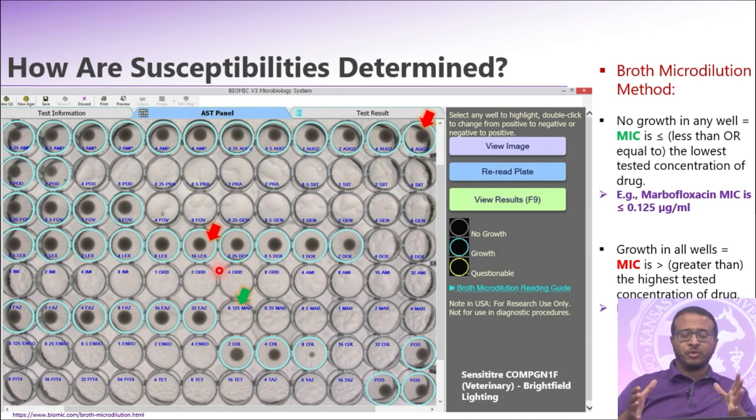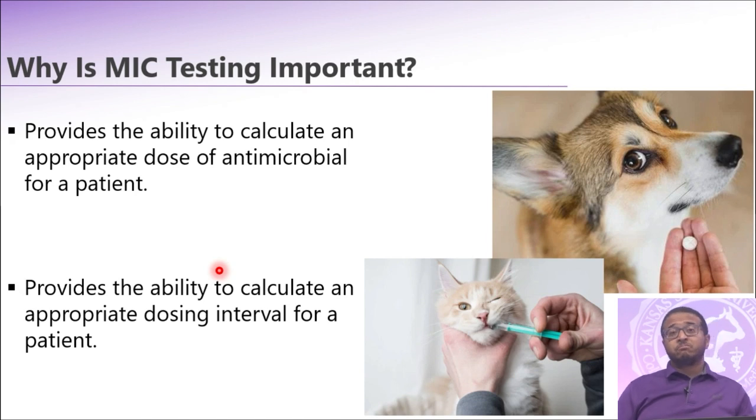We don't know the actual MIC here as we go. All right, so we talked about the MIC here. Why is the MIC important? Why do we care about the MIC?